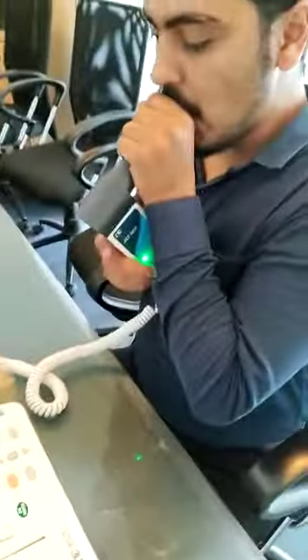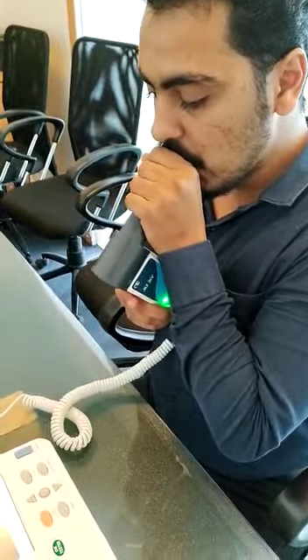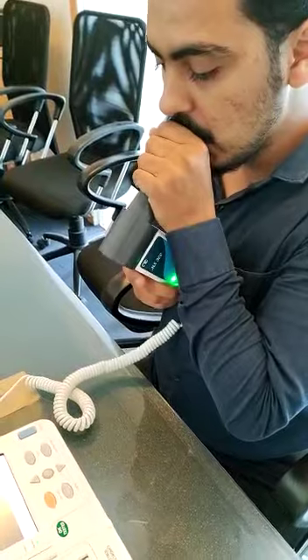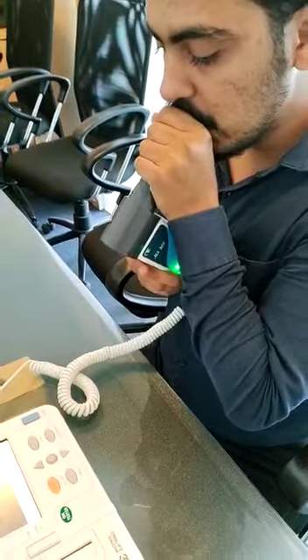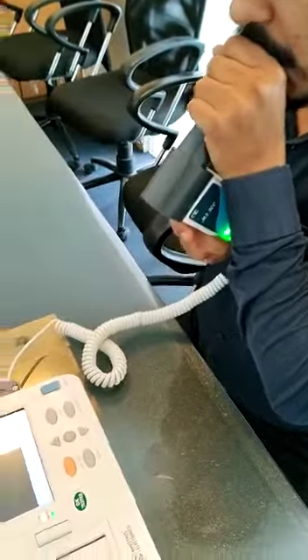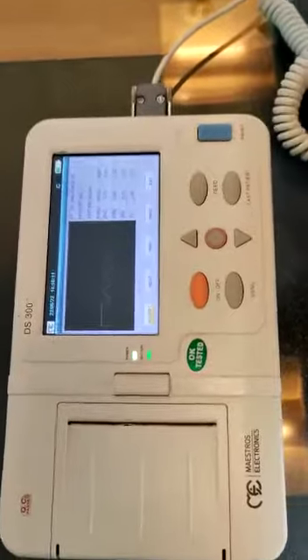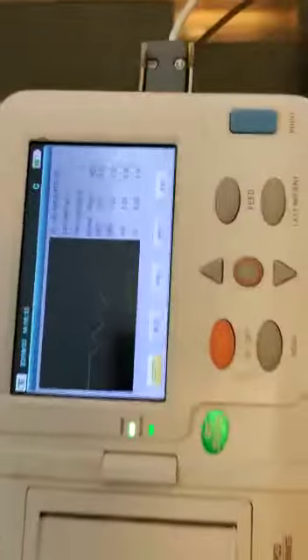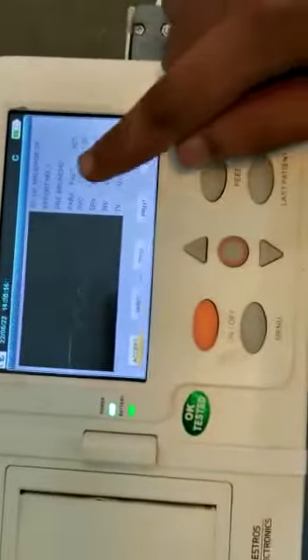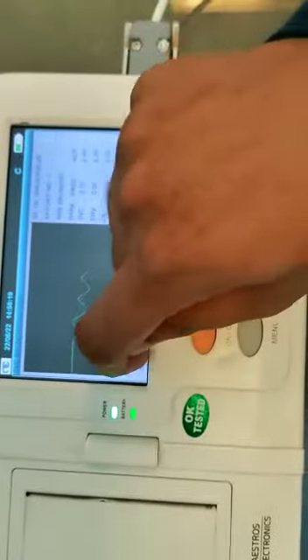Here you have to slowly breathe into the mouthpiece as long as you can. Once you are done, click on stop. You can see the values of effort 1, predicted and actual values. You can accept it.